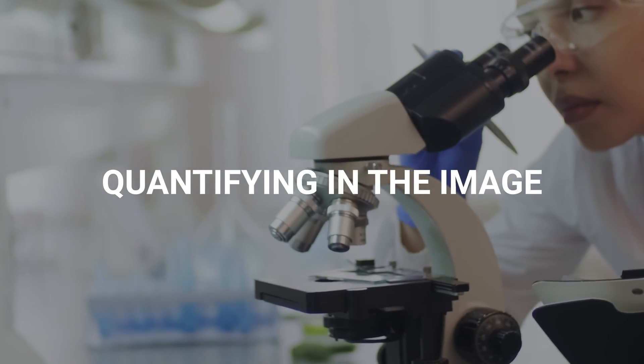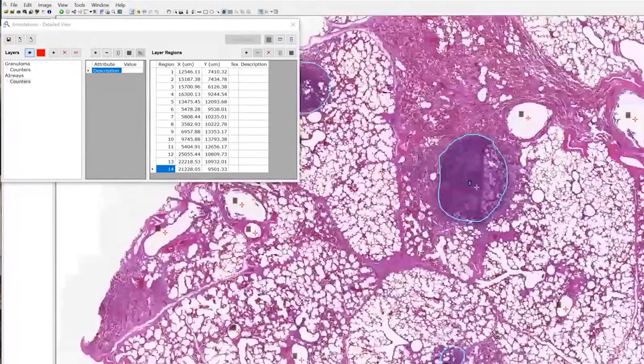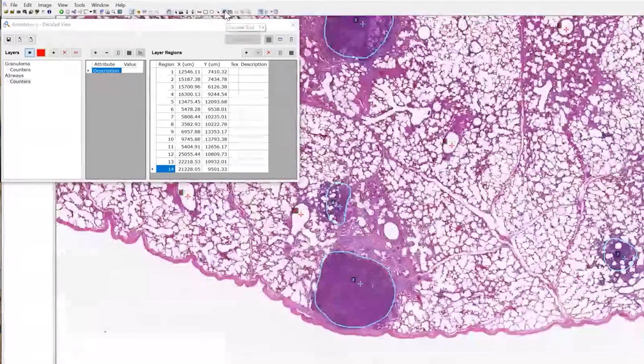The first image analysis application is quantifying something in the image — counting nuclei, delineating area, and measuring it. These are things pathologists are sometimes asked to do manually, like counting Ki-67 positive nuclei in a field of view. AI can now do this not only on whole slide images but also on static images from your microscope camera. You don't need whole slide images for this.